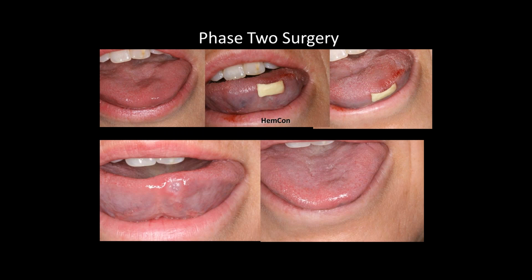Your pigmentation is all in the epithelial layer. So if you're doing it on the gingival tissue, you're going to go down to the basal epithelial layer or down to connective tissue. You don't have to go any deeper than that, and that'll remove it. Depending on the extent of it, you may have to treat it a couple of times, do a portion of it, let the patient heal up and go back. What's harder is amalgam tattoos, because they're all the way down into the connective tissue. You literally have to go down to bone to get that stuff out of there. But I have not done it on the tongue, no, though I've done it on gingival tissue.